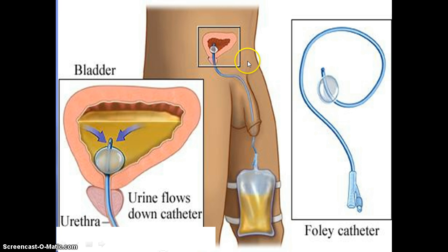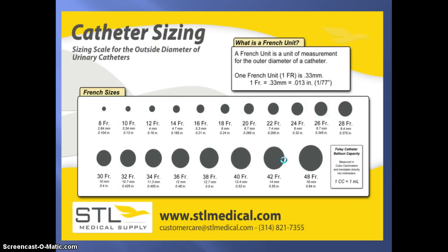the urine. In this schematic, there is a leg bag attached to the catheter itself and secured to the leg. And you'll see other gravity drainage devices that you'll be using. We'll have some in the lab for you.